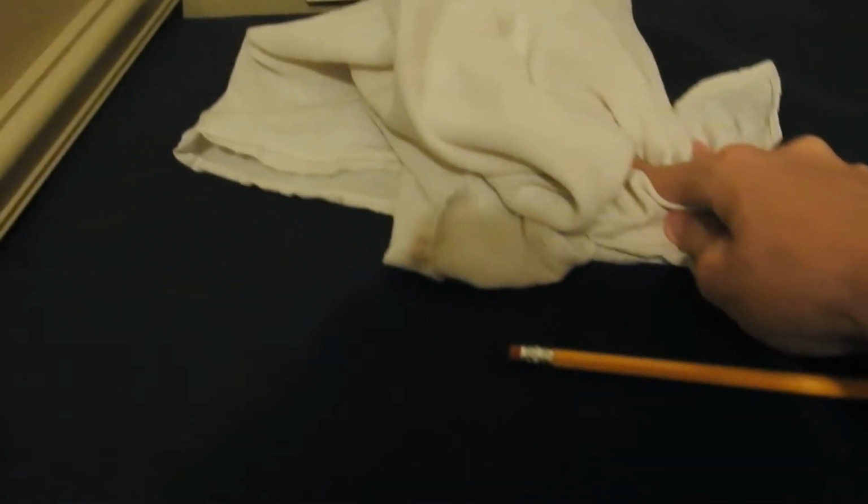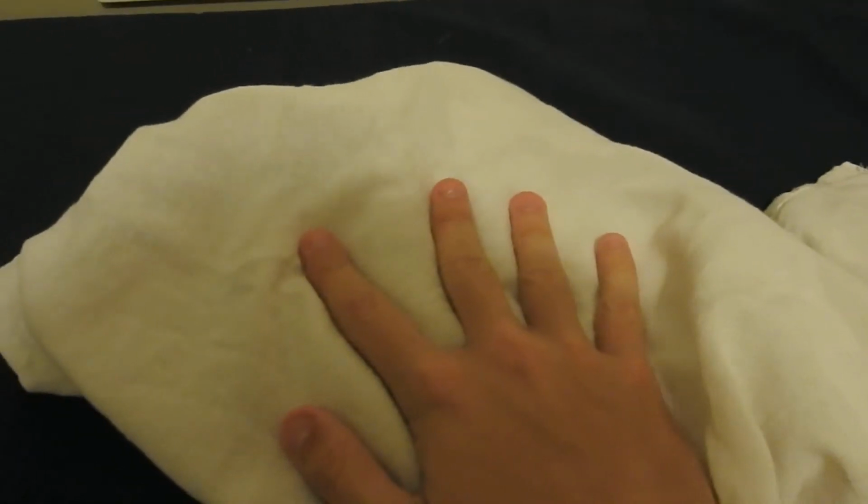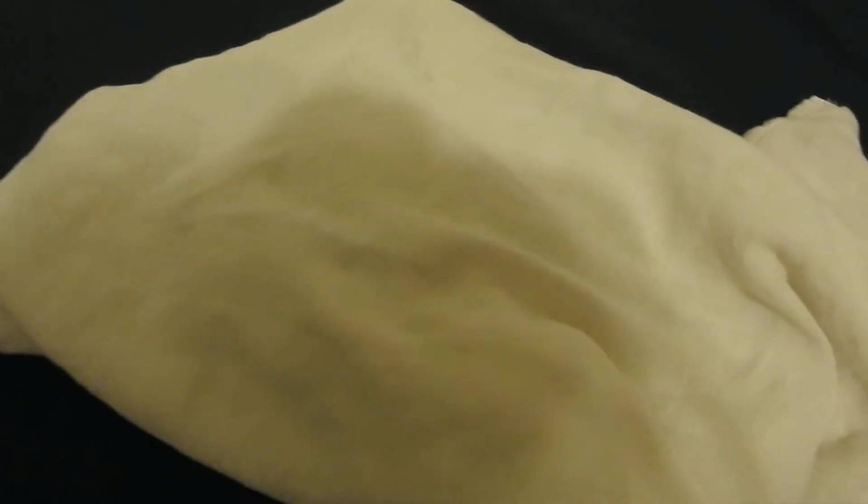For this, you must first get the splint and apply proper padding so the arm is not being pressed against wood. After you have the proper bandaging, make sure that you lay the arm so that the thumb is sticking up for the forearm.